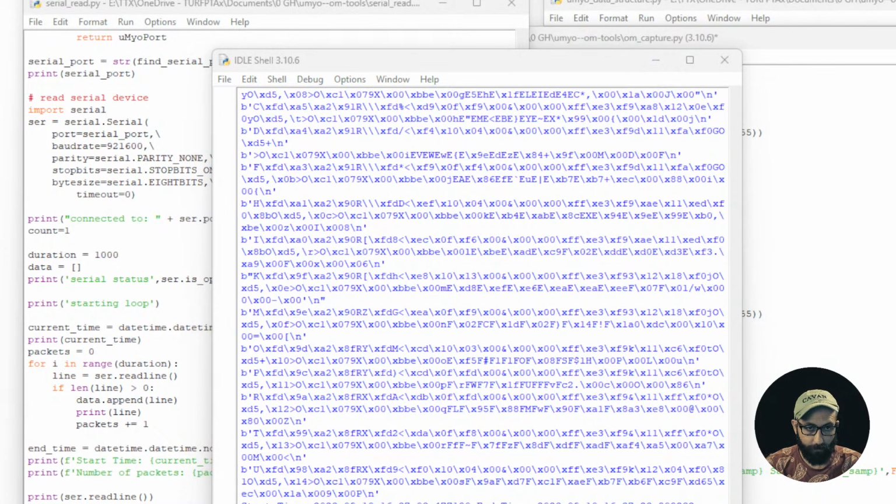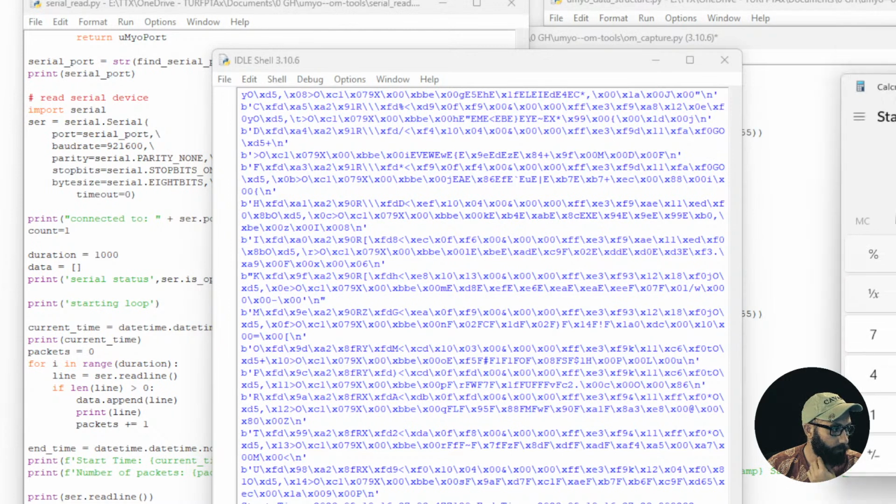So open up the calculator. We started at 3.4 and we ended at 23. So 23.8 minus 3.5. It took 20 seconds to send 1,000 packets. So that's crazy.